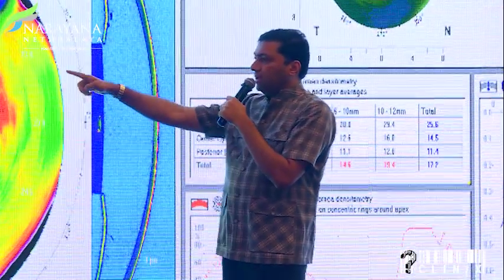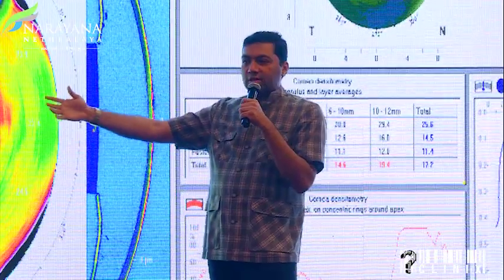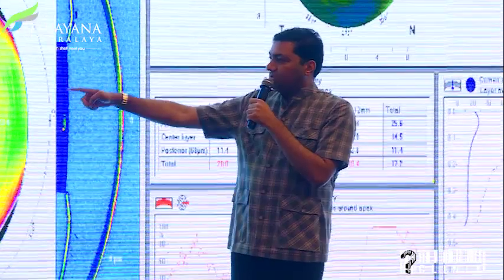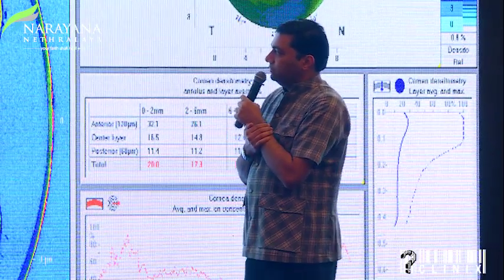So he's found something on Cirrus also, and I don't know how reliable it is, but you can go back and check. People using Cirrus, you don't get a nice beautiful color like this, but I think, can you show? Yeah, this is a post crosslink patient, so it shows in a percentage.